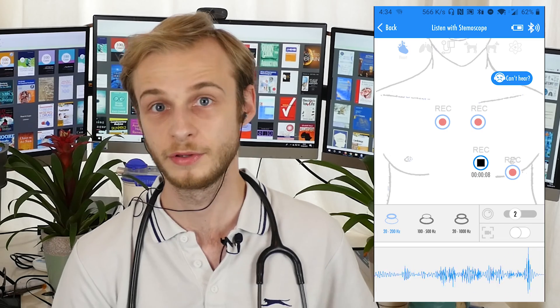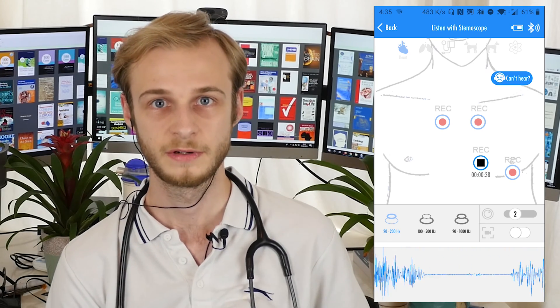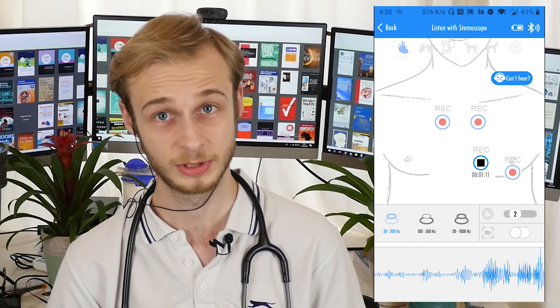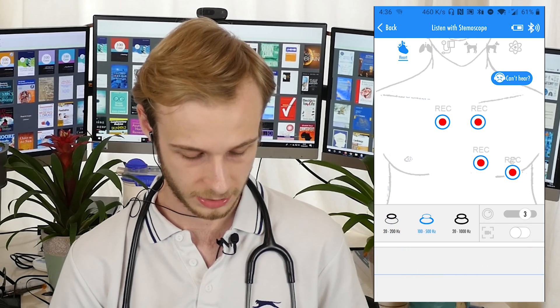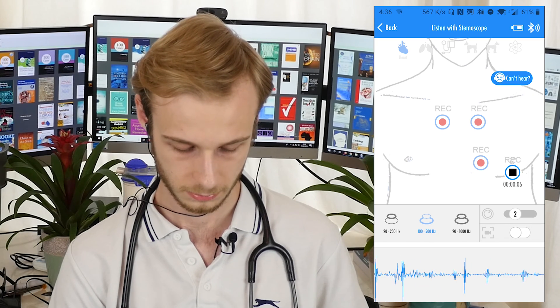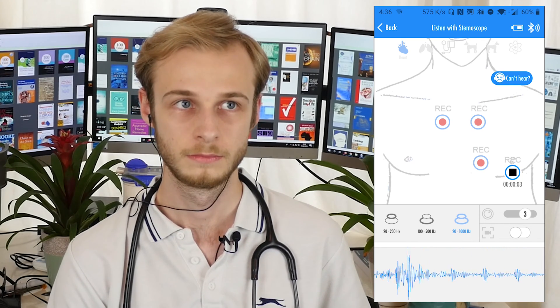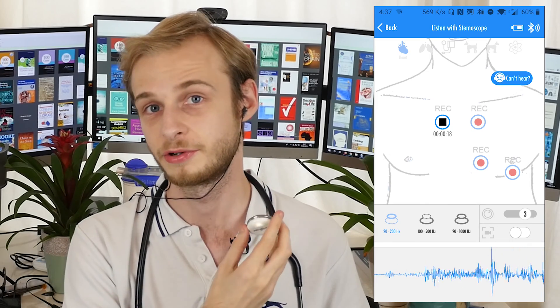Now we're going to try my tricuspid valve — fourth intercostal space, just parasternally on the left. Just in the interest of time, I'm then going to come up to my pulmonary valve. That one's a bit more difficult but it is there. And then across to my aortic valve on the right. So I'm just going to go back to my mitral valve again, but we're going to put it on the diaphragm mode just so you can hear the difference in how it sounds. And then lastly, I'm going to do it on the complete frequency response mode. So we're back on the bell mode — I'm just going to place it over my carotid artery to see if we can hear any bruit.